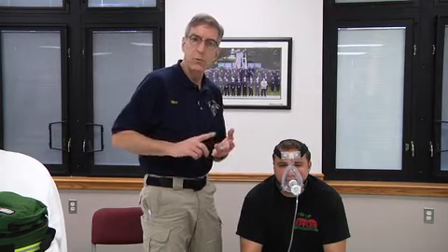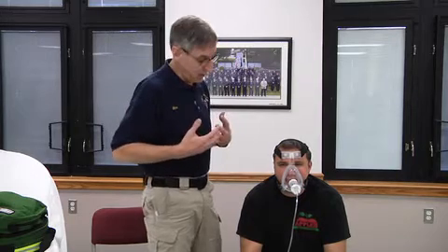The next question is what helps you assess when you should stop using CPAP. You should see a decreased respiratory rate, an increase in oxygen saturations, and a decrease in work of breathing. To measure work of breathing, I ask the patient on a scale of 1 to 10 whether their breathing is getting better or worse. You should also see a decrease in end-tidal CO2, and if you're looking at end-tidal waveforms, a decrease in the alpha angle of the end-tidal waveform.